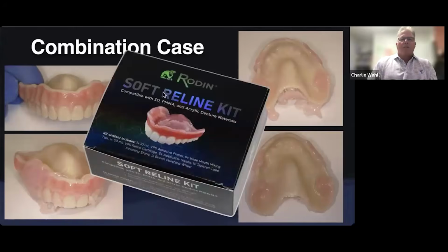And so this is a product by PacDent. Rodin is their print line, soft reline kit. It does stick to 3D materials, PMMA, and acrylic denture materials. It works pretty well. It reminds me of Voco or Tokuyama soft reline, that kind of silicone reline type material. It is a kind of polyvinyl family. So if you were to take a wash impression, you won't be able to get that wash impression out without peeling out your reline. So they do bond together. We use this as our functional reline impression material for most cases.